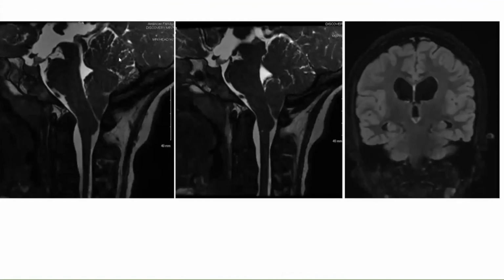So now that she's 12 years old and she's sitting in your clinic, now we can do these really fancy dedicated scans where we look at flow through the CVJ. We are running out of time, so maybe I'll just quickly go over this and pick on the residents for something else. So this certainly shows tonsillar ectopia. That's quite prominent.